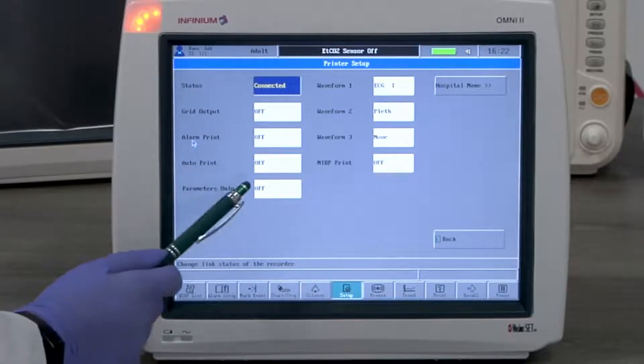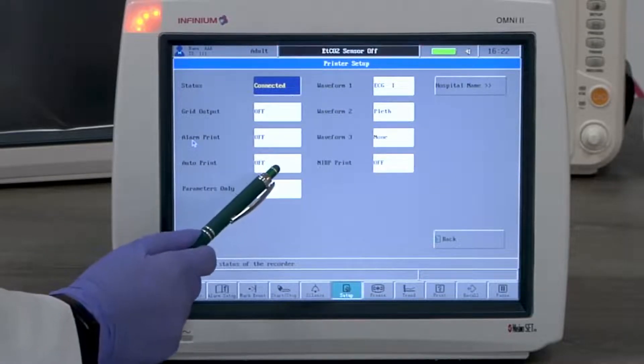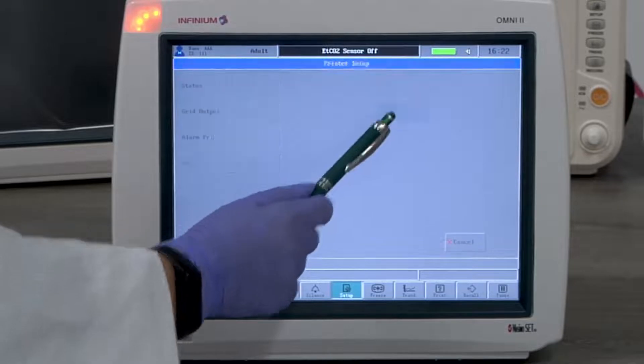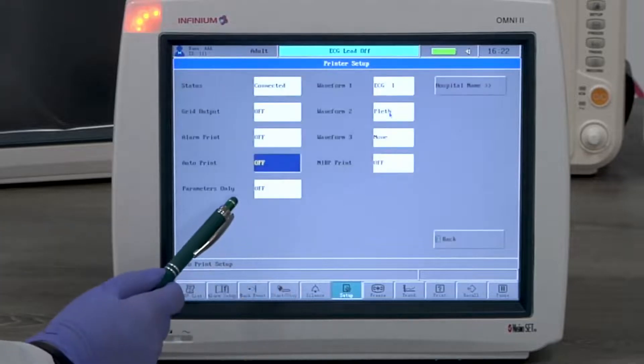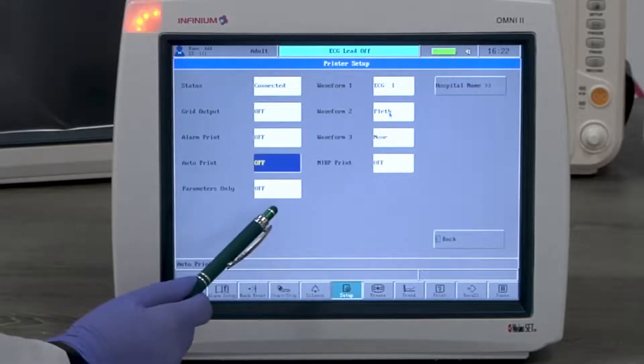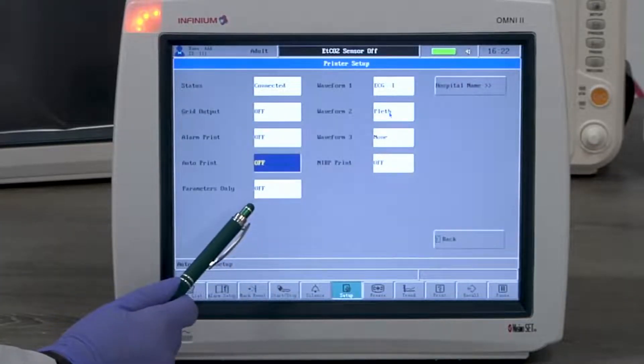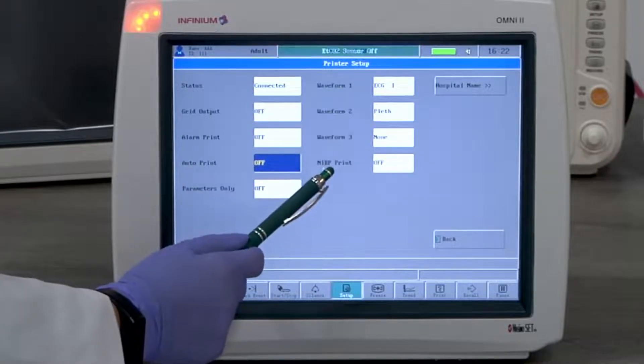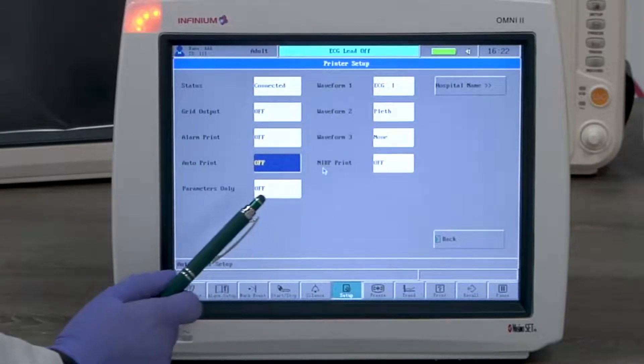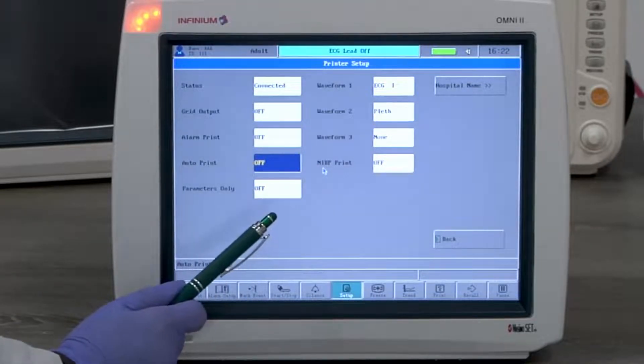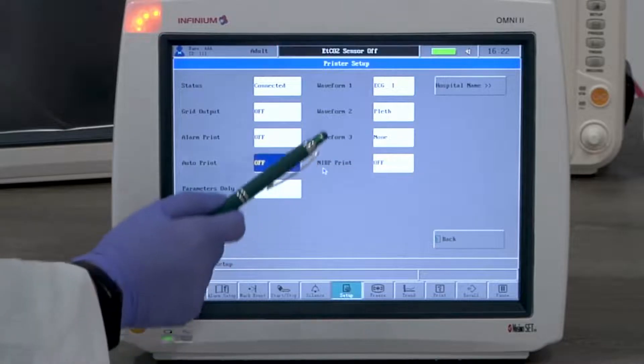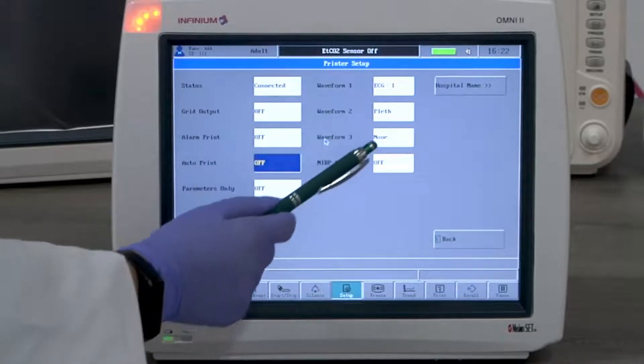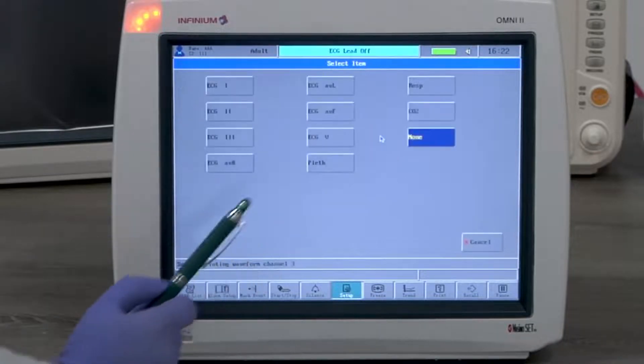Auto print prints automatically based on the set interval. Parameter only, if on, prints no waveform, only the parameter chart. NIBP print, if on, prints automatically when there is an NIBP reading generated. Waveform 1, 2, and 3 are the selected waveforms to be printed.